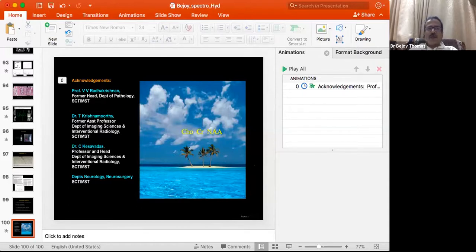So ideally you can do spectral editing and mark manually. The technologists can do it, and the radiologist has to validate it, and then it can go directly. I have shown all these marked on the machine, which I have actually added, because we are editing the spectral peaks and it's marking on the machine itself. So that is possible, but somebody has to take responsibility for marking that. That is usually done by a radiologist. Under supervision, a radiology technologist can do that, but the radiologist has to validate and vet it.